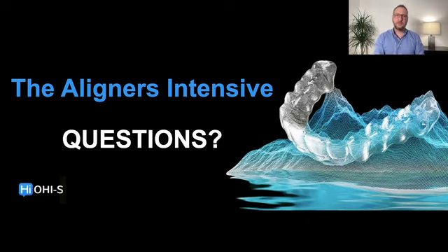And also I like to use what I believe DSD invented, the 12 o'clock angle that takes the photo from above. So we can see in this angle, the camera coming like I'm showing to you in the webcam, the relationship of the upper incisor with the lower lip to understand the anteroposterior. Okay, so the profile also to understand the anteroposterior. Okay, and with these photos, I can calibrate.